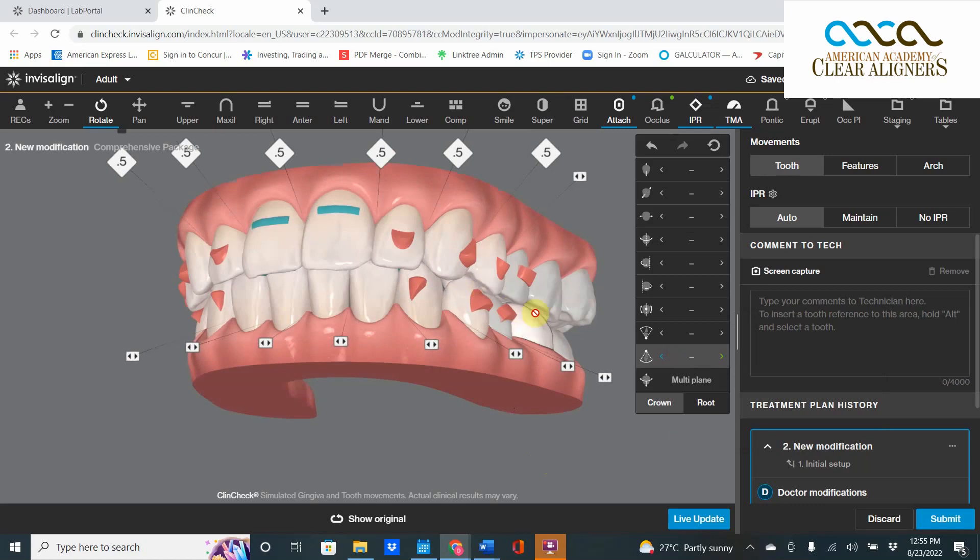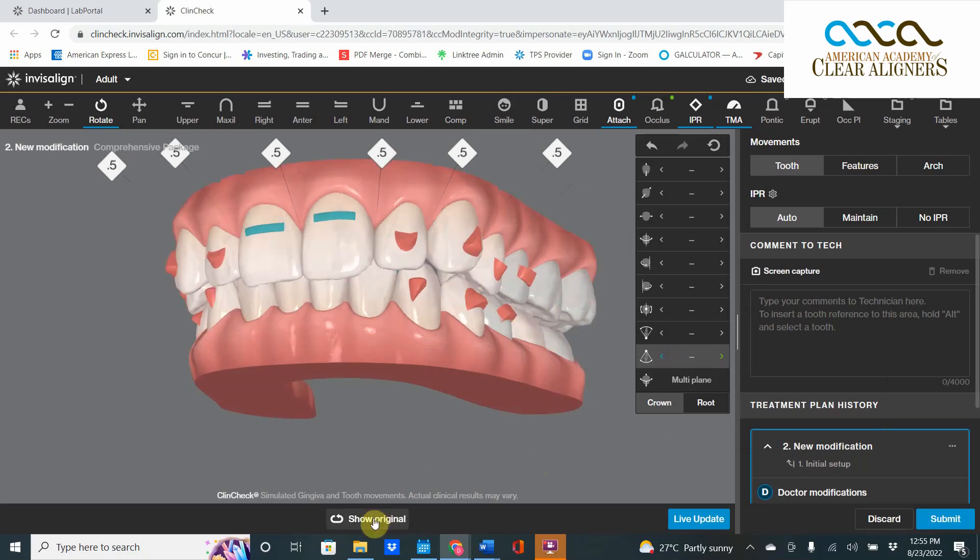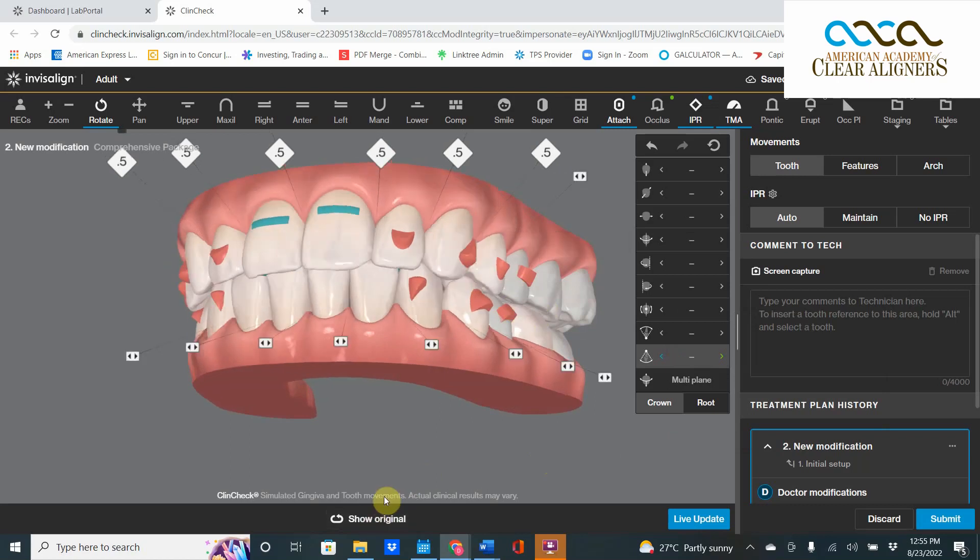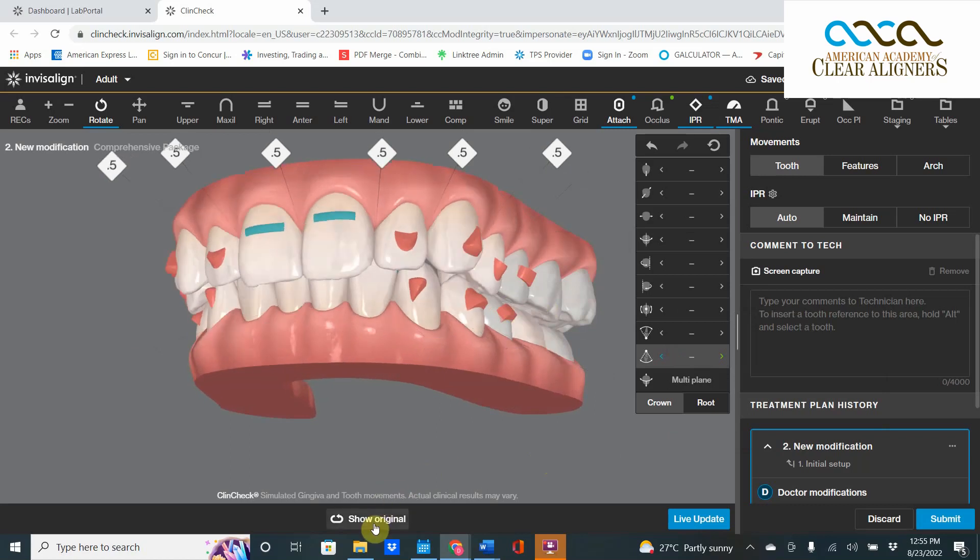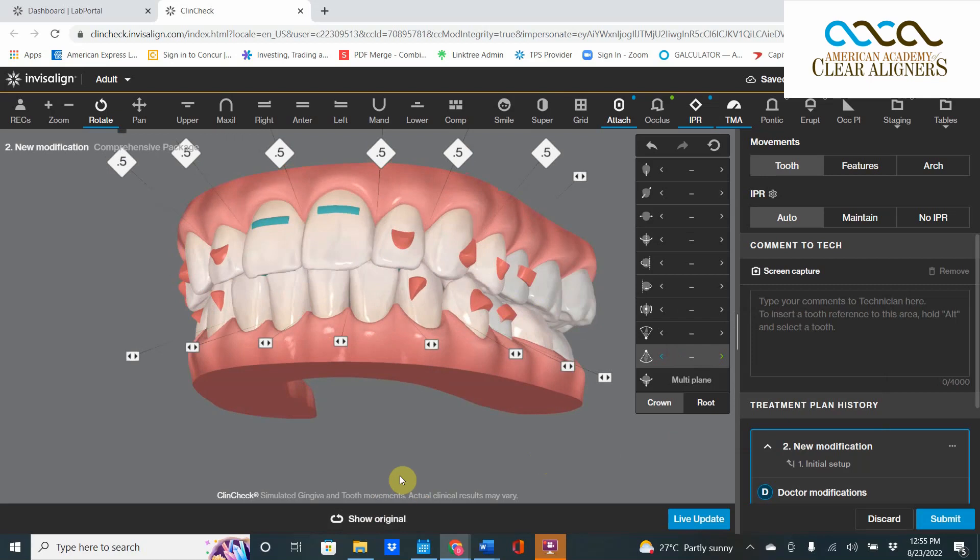Beautiful occlusion here, way better than the initial Invisalign thing. Thanks very much and hope this was helpful to you. This has been ClinCheck Theater Thursday. I am your host, Dr. David Galler.